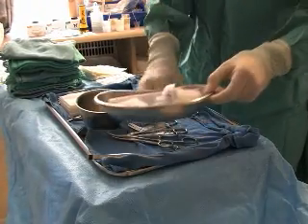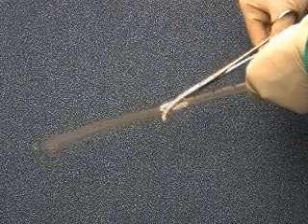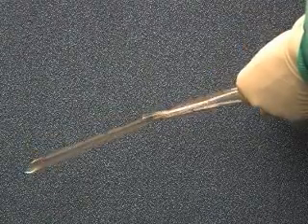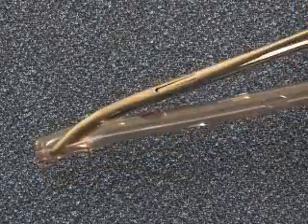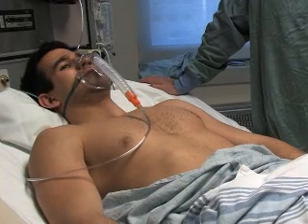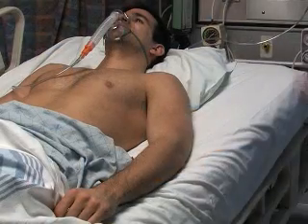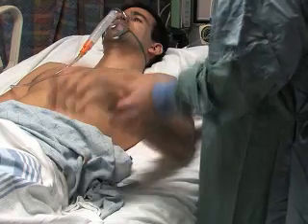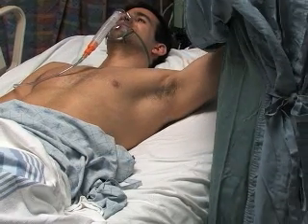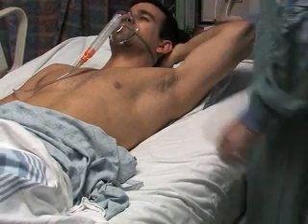Once the chest tube tray is open and all the key instruments are identified, occlude the proximal free end of the chest tube with a clamp or forceps. Next, with another clamp or forceps, grasp the distal end of the tube. This will aid in passing the tube through the tract. The patient should be positioned either supine or in the semi-recumbent position. The ipsilateral arm may be maximally abducted to the side of the patient or, alternatively, positioned behind the patient's head in order to have optimal exposure of the insertion site.